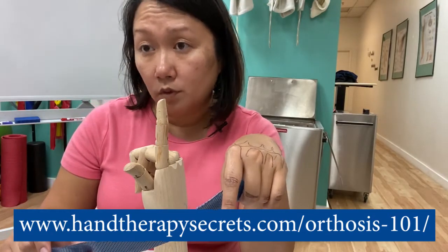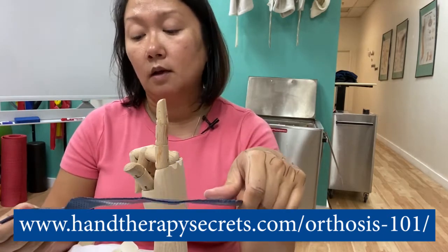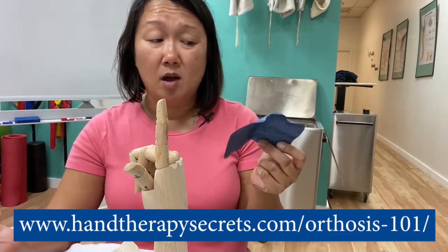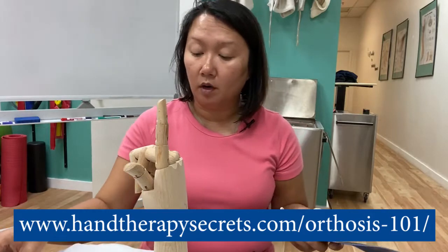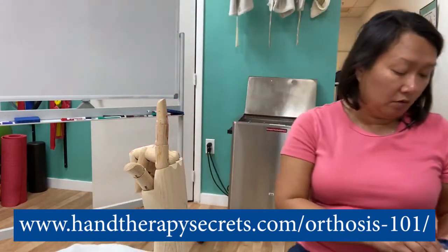relative motion orthosis, or quote unquote yoke orthosis, that kind of stuff. So there are so many different uses for these quote unquote scraps, but they're not really scraps, right? They're really good for you to use and make so many different orthoses, but really just get your practice in, you know?